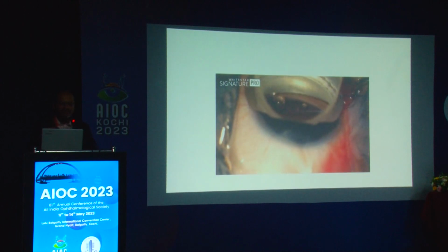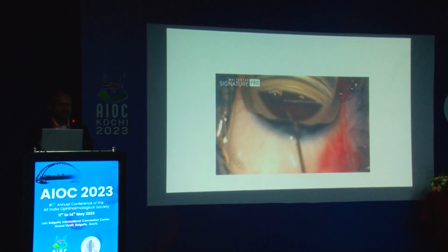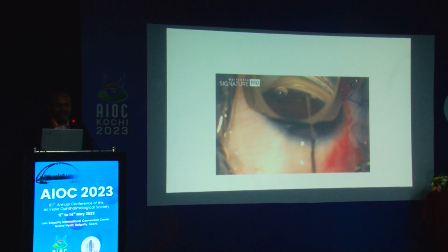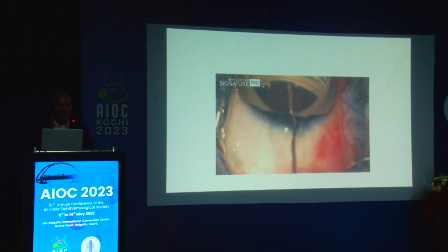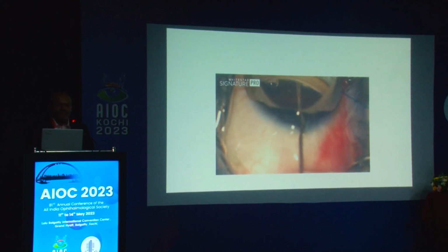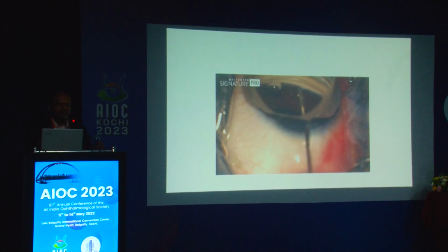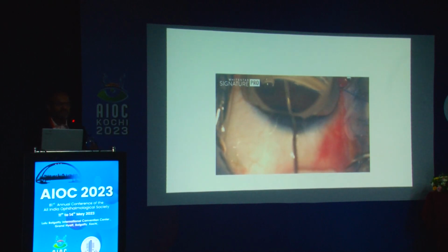So this is the bubble trouble. Once you inject the viscoelastic, make sure you inject viscoelastic outside and then go inside and inject viscoelastic. So avoid that. And then you catch hold of the forceps and introduce into the trabecular meshwork. This should be a little easy, but there will be a little bit of struggle. As Dr. Mahesh has mentioned, your arms are extended, so you have to reach out and do the procedure. So it's technically a little difficult. You have to get the hang of it.